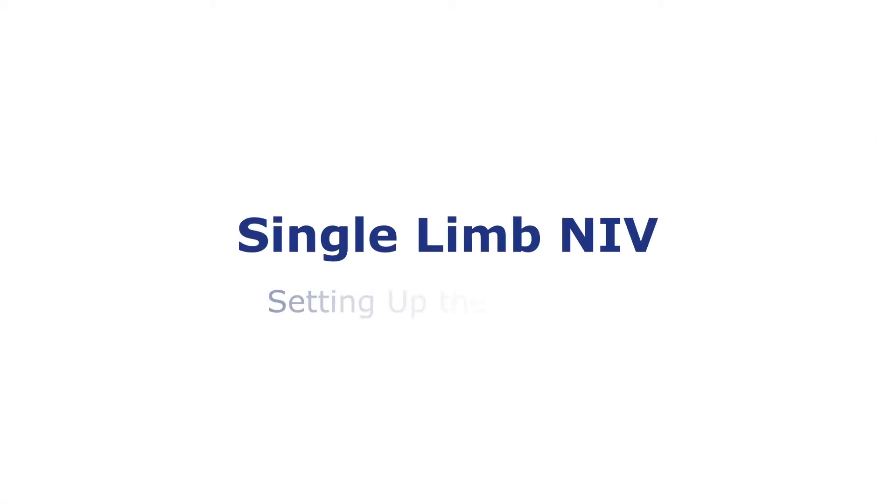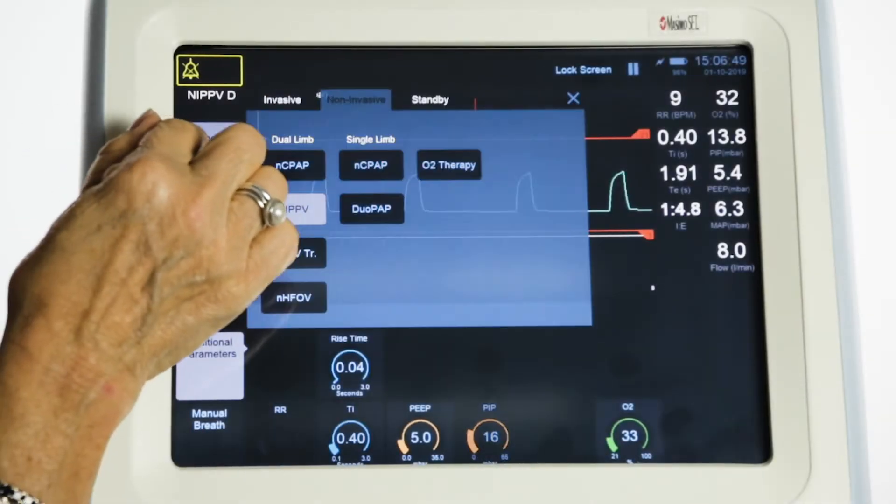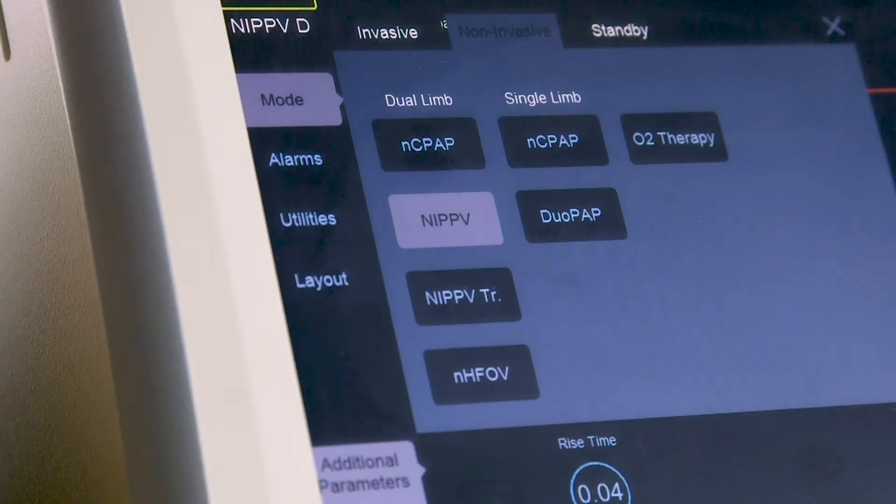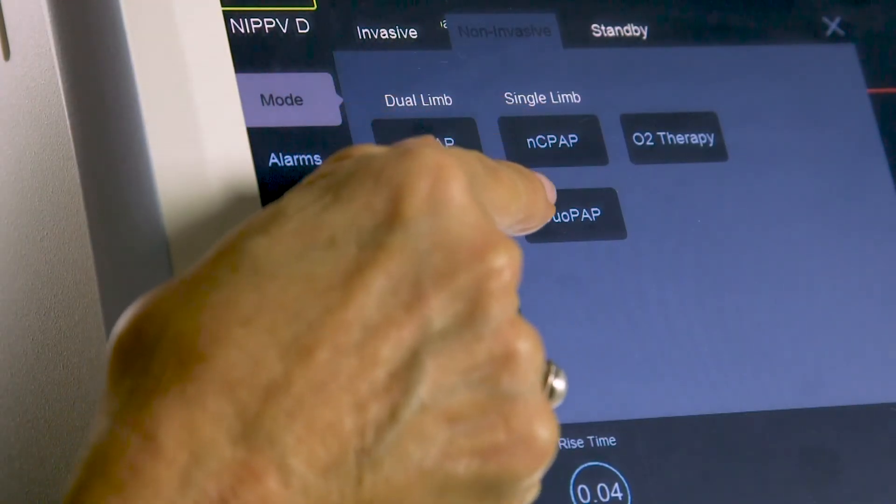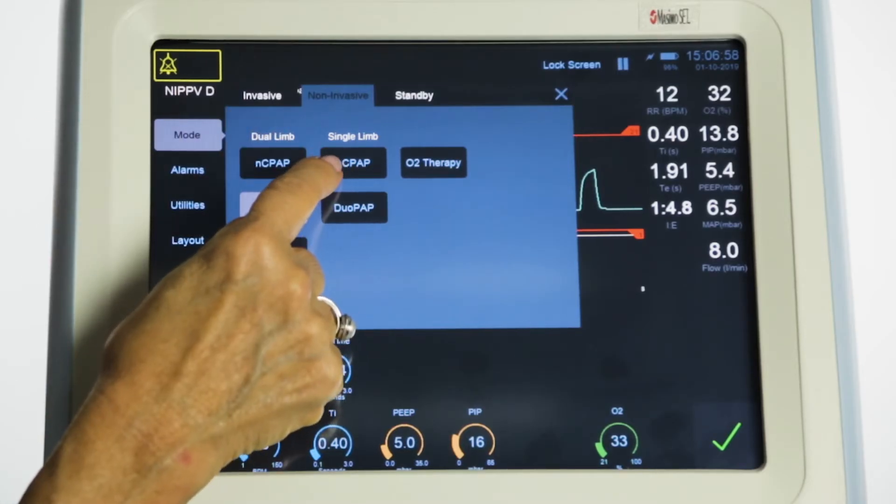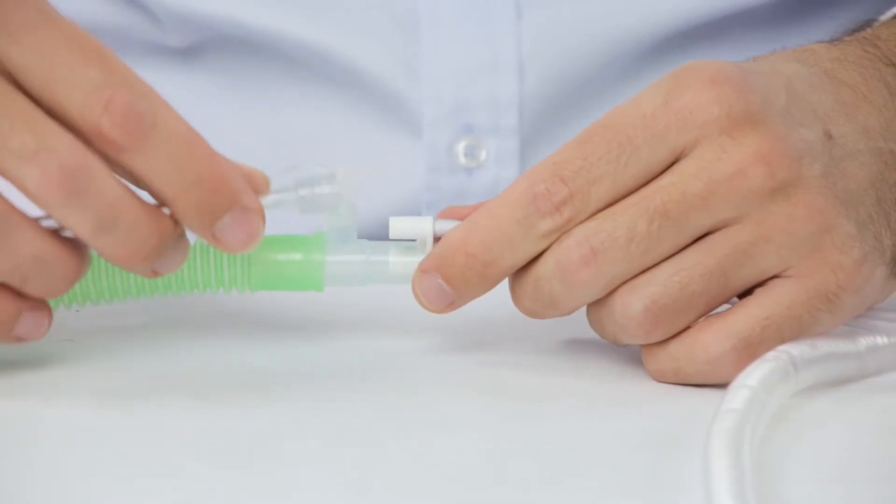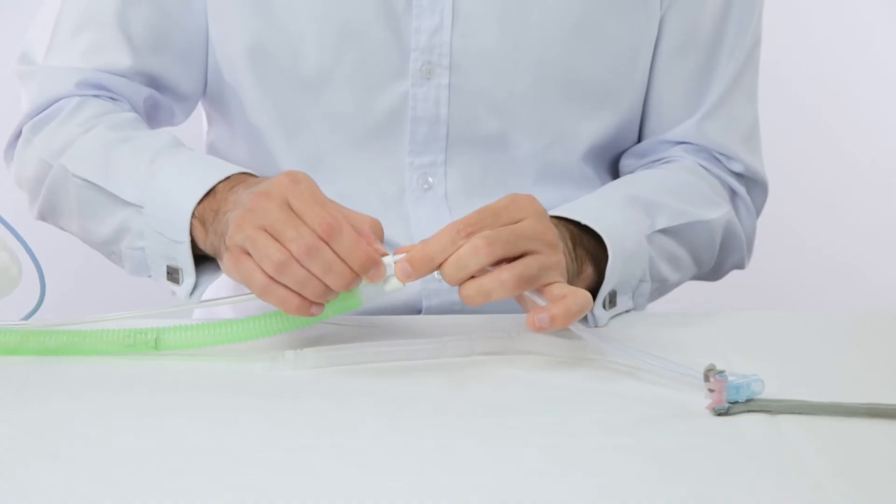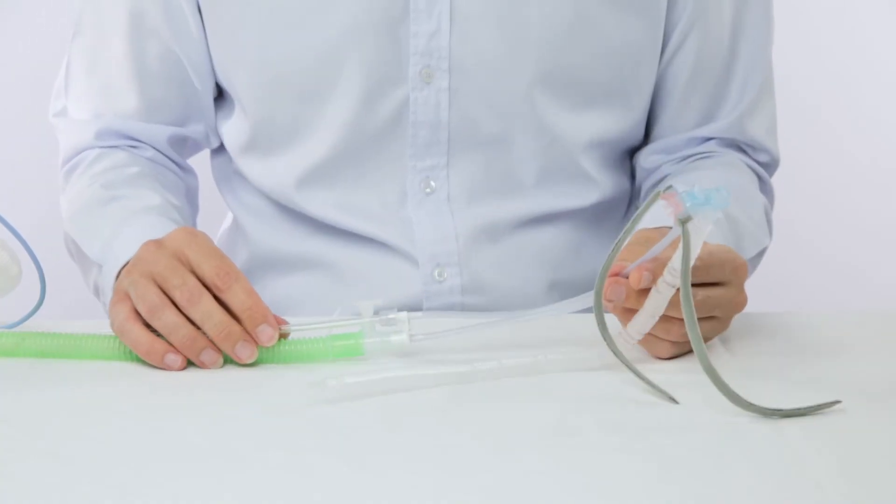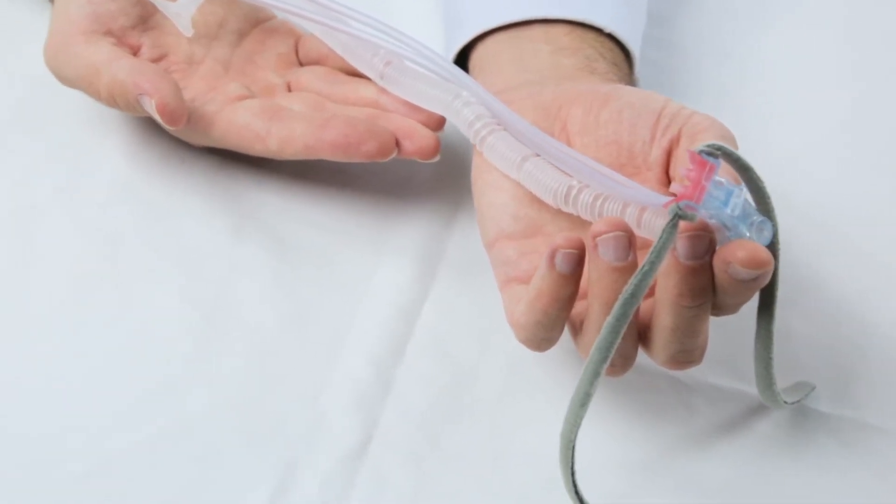Setting up the SLE6000 for single limb non-invasive ventilation. The SLE6000 infant ventilator has the facility for two different modes of single limb non-invasive therapy: NCPAP and DUO-PAP. Each mode uses the same accessories and circuit configuration already described in the previous NIV video. SLE recommends the use of the SLE1000 CPAP generator.